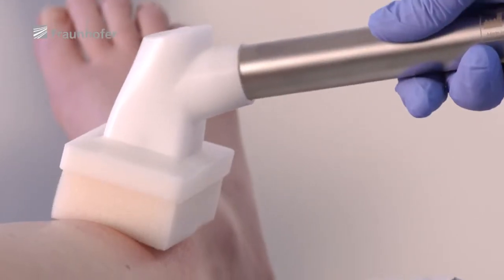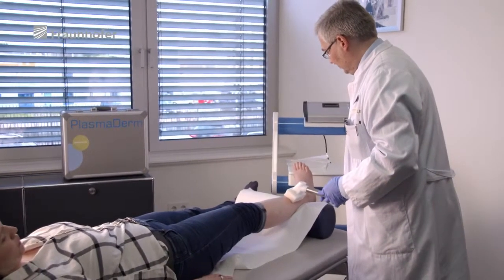In the study we conducted to obtain approval for PlasmaDerm, we found that plasma can reduce the amount of bacteria on wounds and promote wound healing. That's a major benefit for patients.